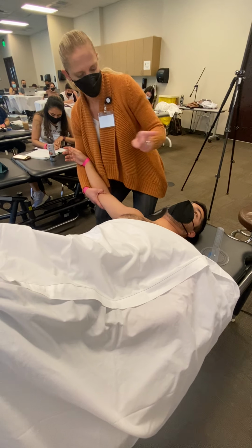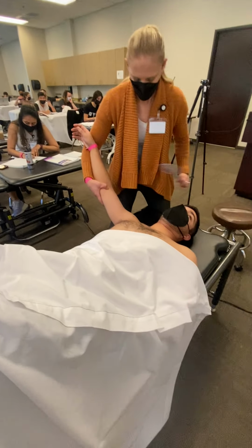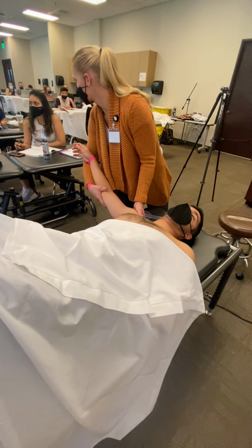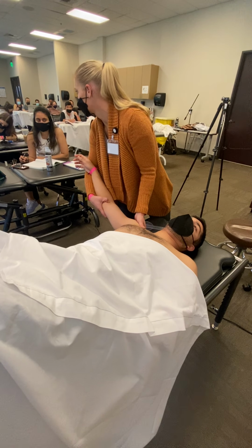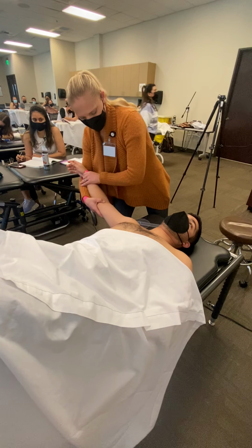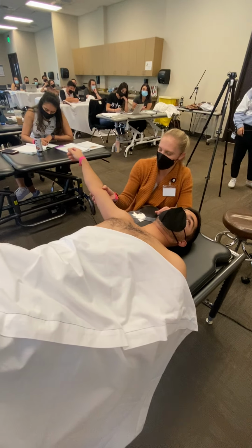Can I actually have you move that way a little bit? Sorry. Because I want to be able to measure to the table. Yeah, you're coming into horizontal abduction. Starting to feel that there. You can support the arm there, squat down.